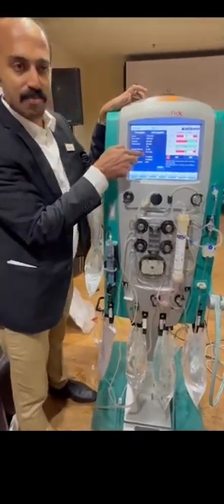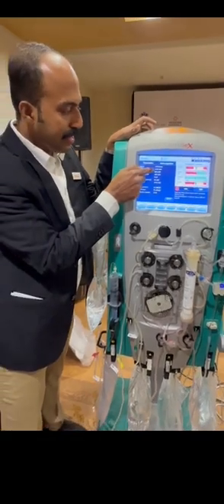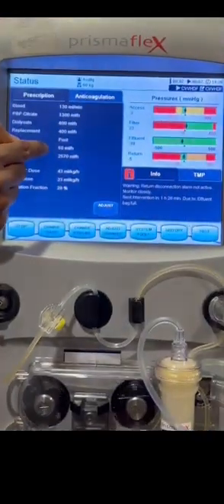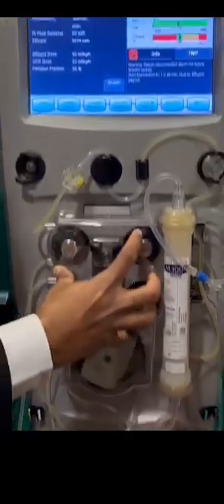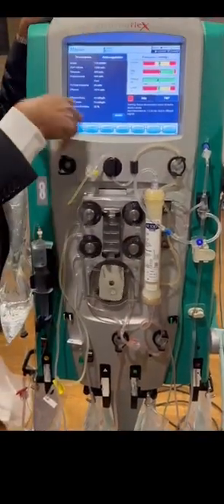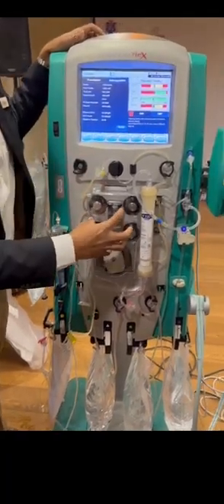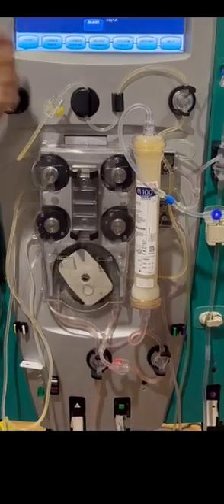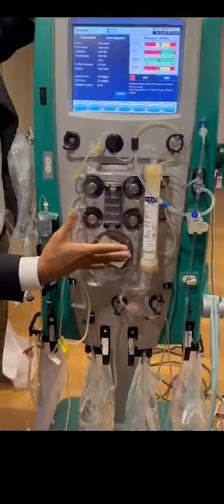This is not fixed by me, the machine calculated it. I have given the rate of dialysate, replacement and fluid removal, and the machine calculates. So from this pump you can identify the dose. The dose is very high. I just took the patient weight as 60 kg, which is why we can decrease it. I will show you the exact dose later on prescription. I will set it, so from here you will come to know how the CRRT works.